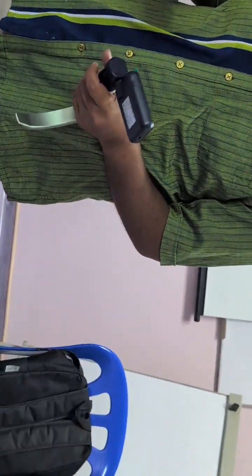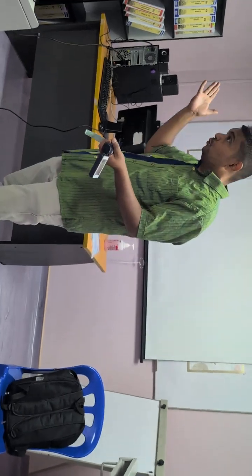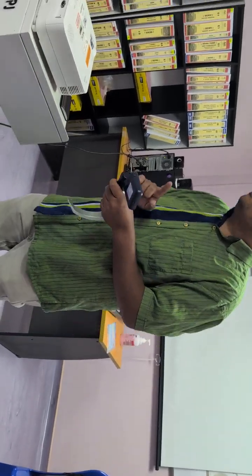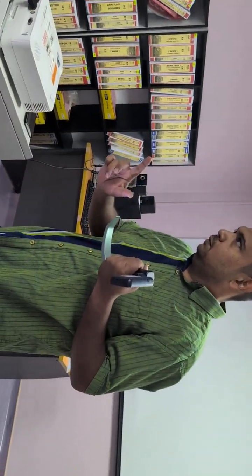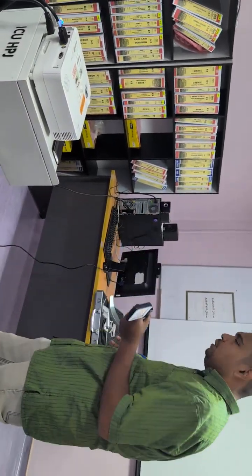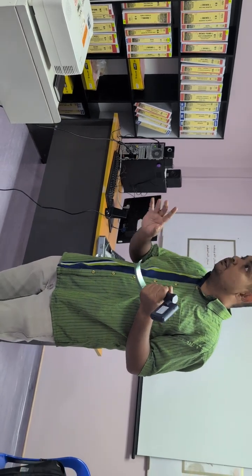Why is the recording important? Medical legal purposes, especially in the ED lah. Okay, here not so much. Okay, you start recording, you leave this on so that the anti-fogging mechanism works. I have got multiple videos to show you that if the anti-fogging works well, the intubation is going to go well.